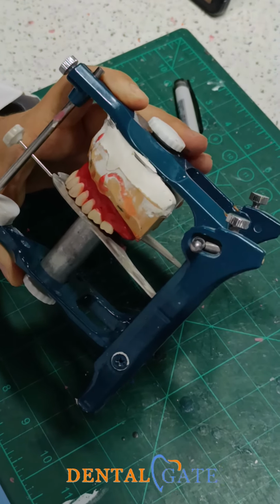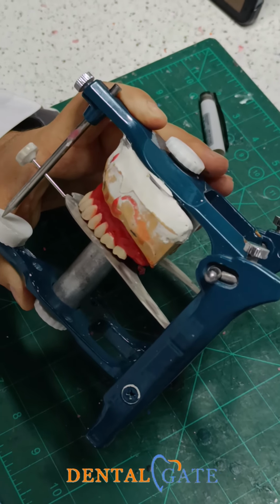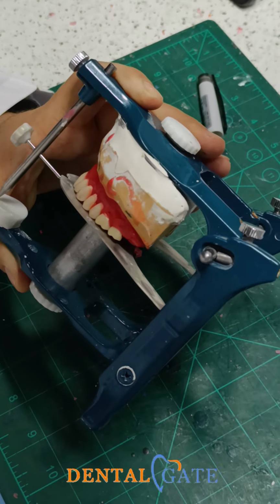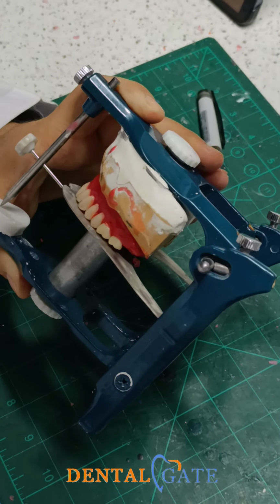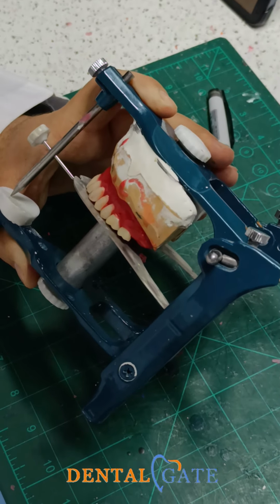Yes, if you make an impression with the normal occlusion and put all the teeth upon the table, horizontal plane, and make a check, it seems there is no horizontal plane.